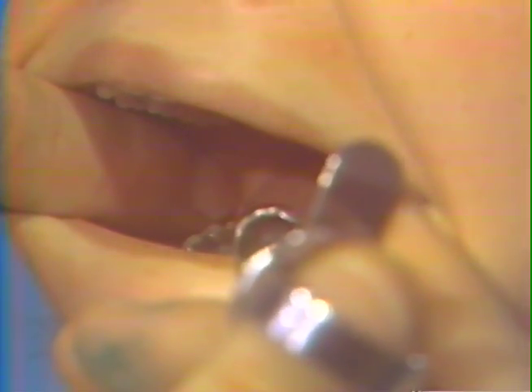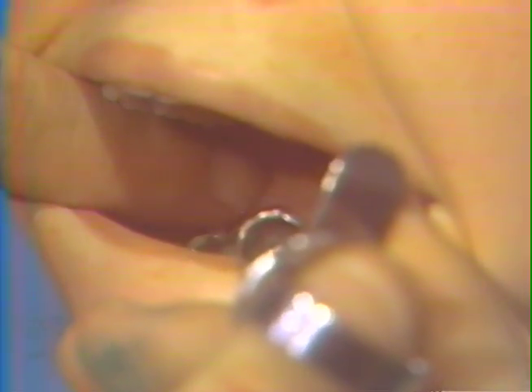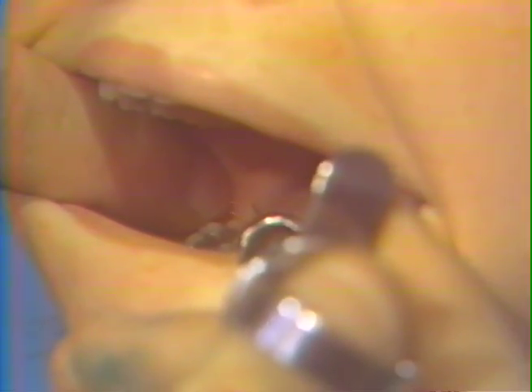If this ridge is encountered in the injection, the needle is displaced medially with the palpating finger to clear the internal oblique ridge, and then a direct thrust movement back to the area of the foramen is made. The needle is withdrawn in the same plane. For the inferior alveolar nerve and lingual nerve of the left side, now open your mouth.